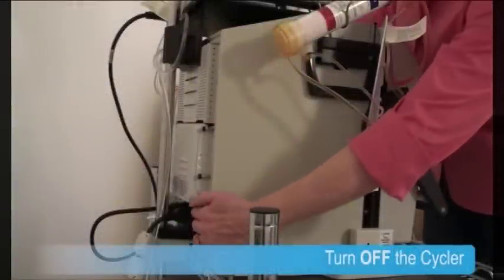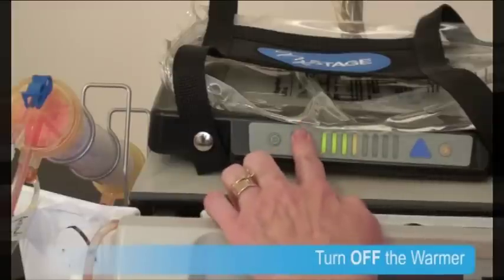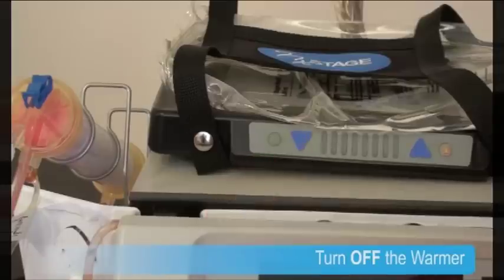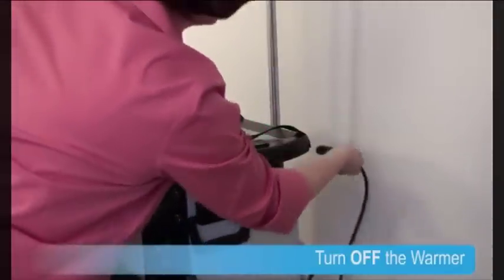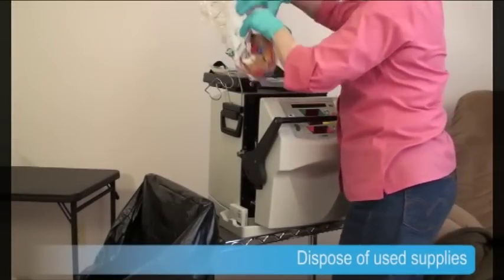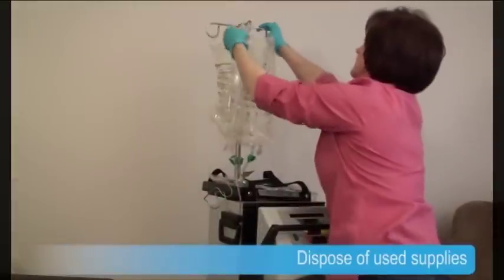With all of her lines disconnected, she can safely turn off the cycler and turn off her warmer by putting it in standby. She presses the down arrow until the standby indicator lights are lit, then disconnects the power cord from the cycler to the warmer. With everything off, she can dispose of used supplies like the cartridges, the gloves, and the empty dialysate bags.